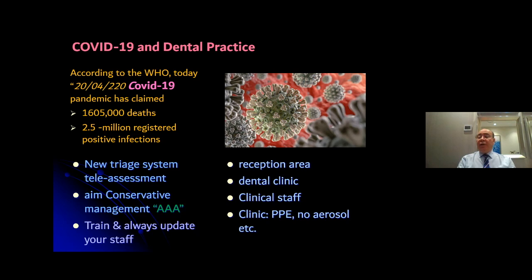I wouldn't attempt to use a drill because you're going to create an aerosol and it will be bad for you and for the nurses. Yes, they say you can prepare the room with negative pressure, but it's not 100% immune. So do the right thing, and I'm pretty sure it will be okay. The most important thing is to stay safe.